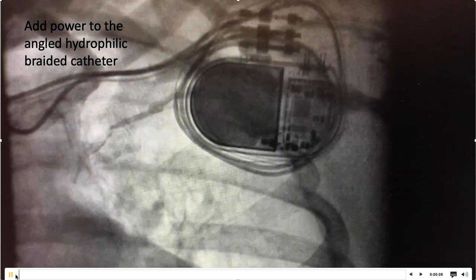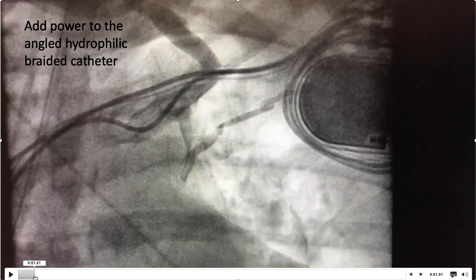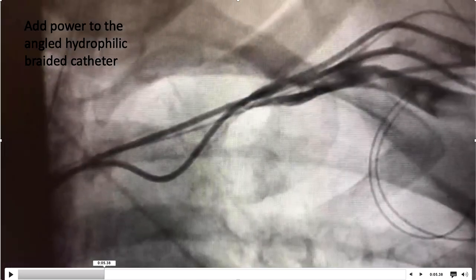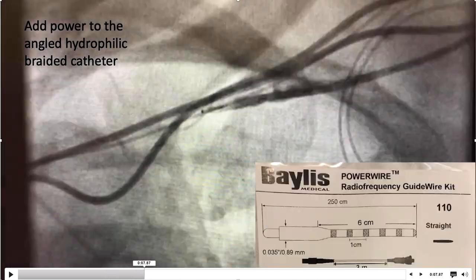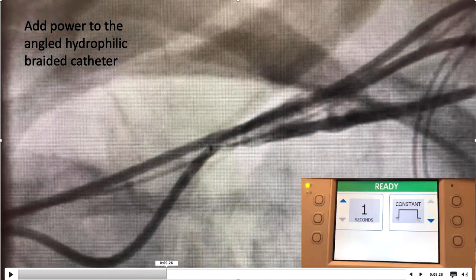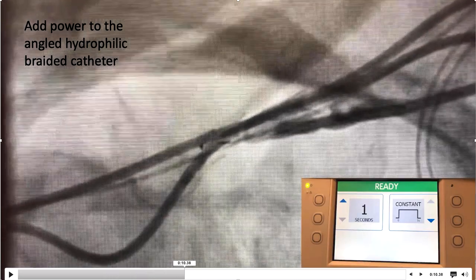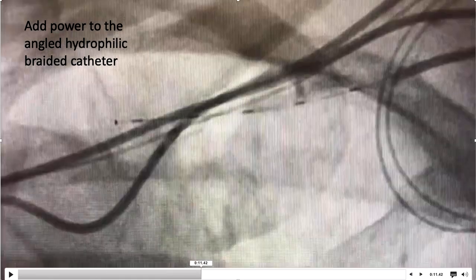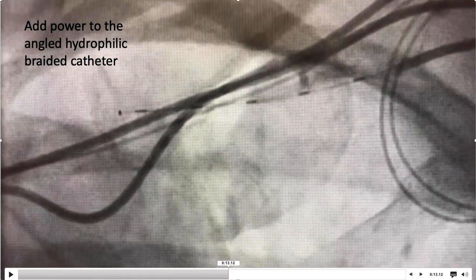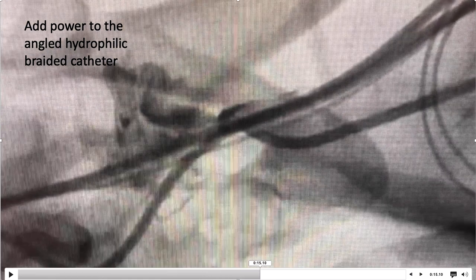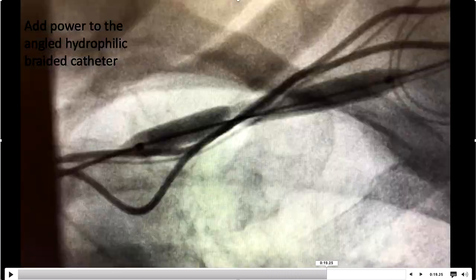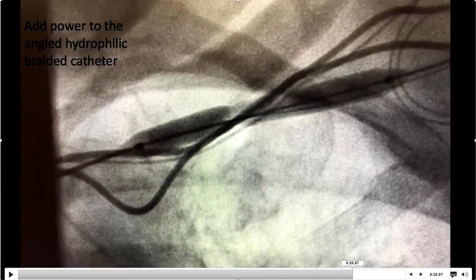Occasionally you can't cross with a wire and catheter, so one option is this power wire. We place it across the occlusion and use one second of RF energy — then we're through the occlusion.